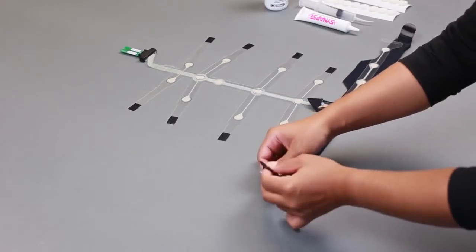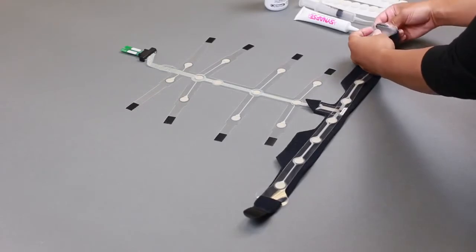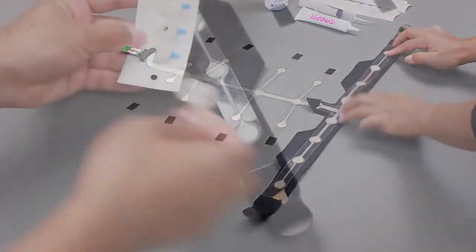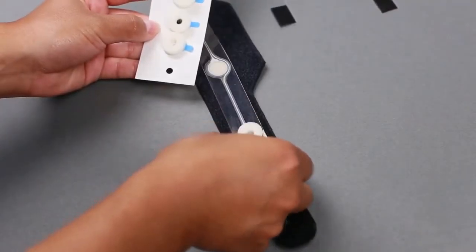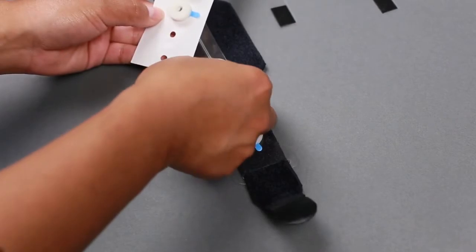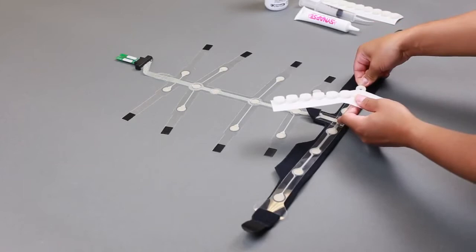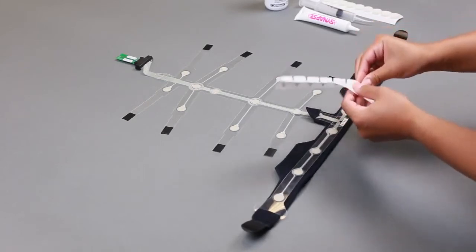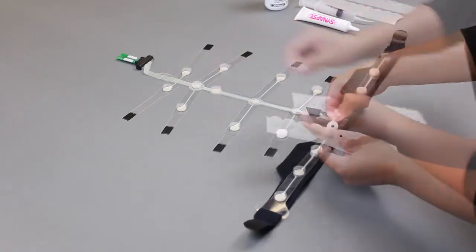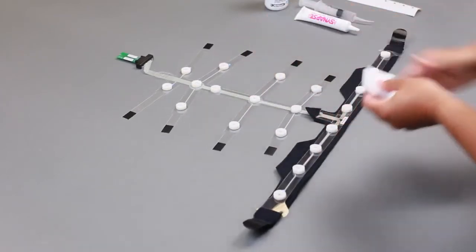Once the strip is secured to the strap, feed each Velcro end of the strap through the appropriate slot on the strip arms. Next, apply the adhesive foam sensors to the strip. Using the black circle surrounding each site as a placement guide, affix one foam sensor to each of the 20 sensor sites on the strip. Place foam sensors so that the blue tabs are aligned with the strip, making for easier removal after the data acquisition. Gently apply pressure to the foam sensors to ensure they properly adhere to the strip.